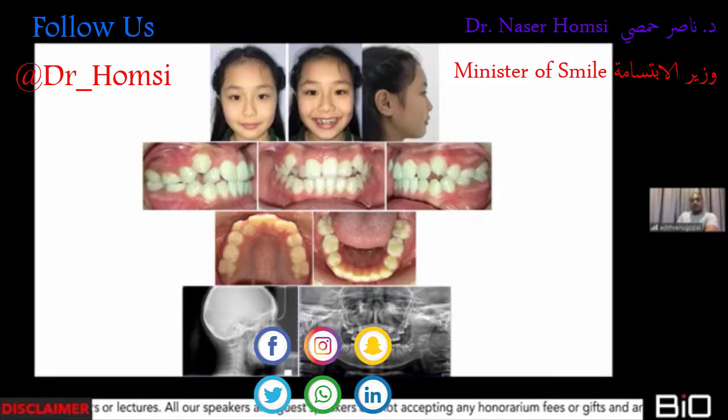It's just that I work for a hospital, so you can understand that a self-ligation bracket costs more, so we charge the patient more. And for that particular reason most of my patients have self-ligation. When a parent comes in with their daughter, I tell them, okay, this is the conventional bracket, this is the Damon or the self-ligating bracket, and this is a little more expensive because of the fourth wall and the clip, and you don't have to use ligations and all those things. The parent definitely wants the better one.